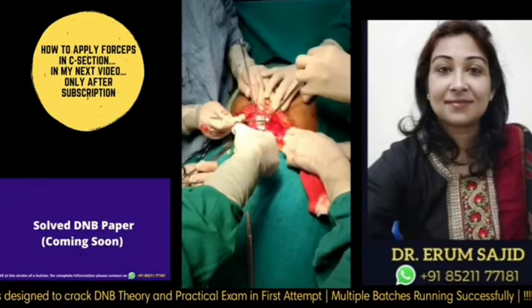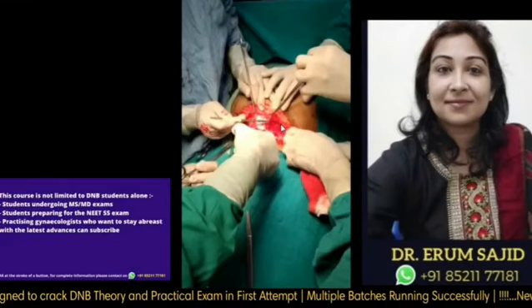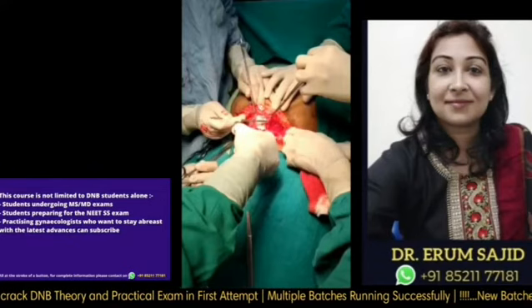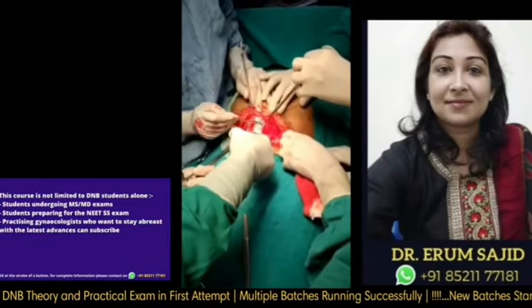And this gentle, what I'm doing over here with the scalpel is just gentle ease of my scalpel on the fascia here to just let this pulling take place. So let's go forward and let's see what happens. Very gentle strokes of scalpel, because it's such a sharp instrument.